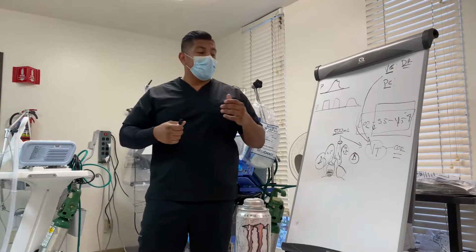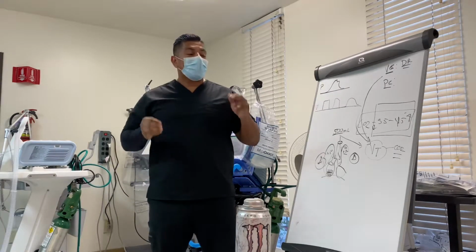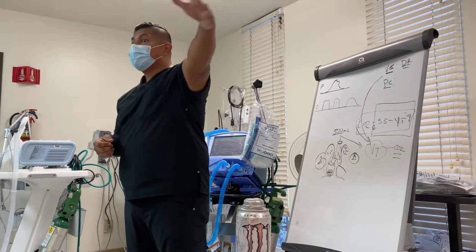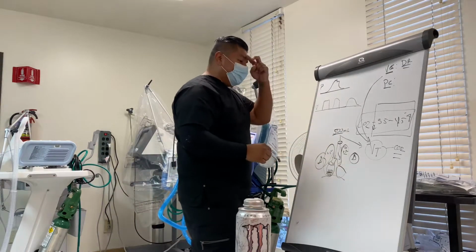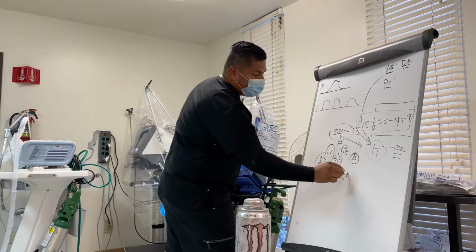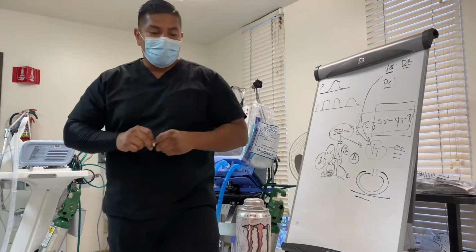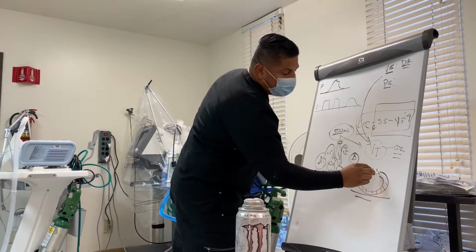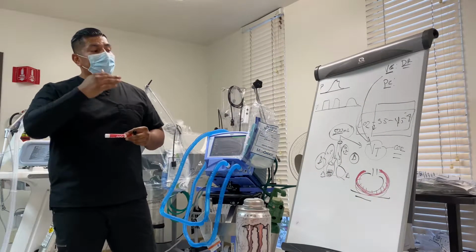When you hyperexpand anything, if I were to scratch myself, if I were to injure myself, same as the alveoli, what is the body's first response? If you ever smash yourself, boom, what's going to happen to my hand? Swelling. It's going to swell. That happens at a microscopic level as well. When things get unevenly distributed, when you are forcing a certain amount of ml, doesn't matter what the pressure changes are, you at the alveolar level are going to cause hyperexpansion, which then causes swelling, which causes micro injuries, and the response to that is swelling. Now you've gotten yourself into even more trouble.